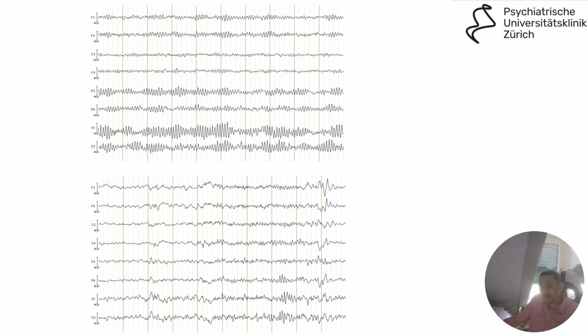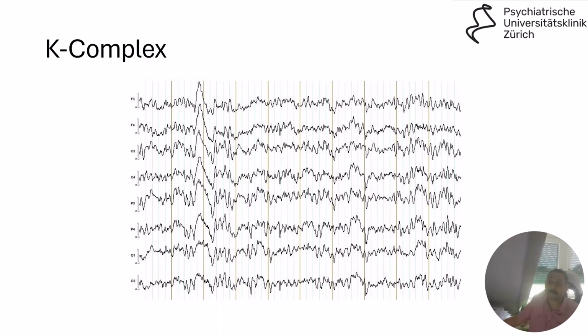You hear some large waves in the alpha range, some theta kicking in after, then some desynchronization, and here you even have some more rhythmic alpha, but only at some electrodes. So this is a very arrhythmic polyphasic pattern, while this is a very rhythmic and smooth pattern over here. So just for you to see the difference.